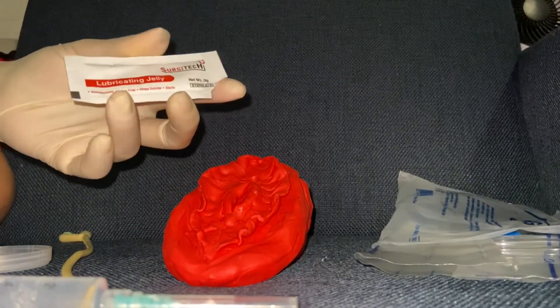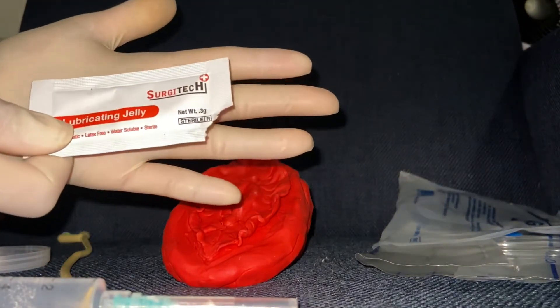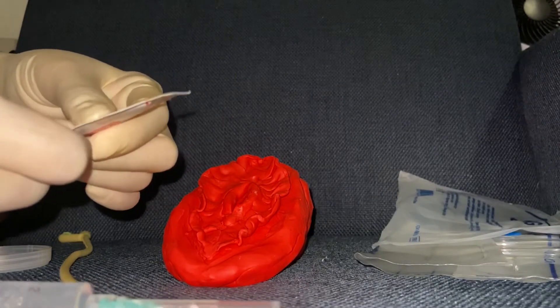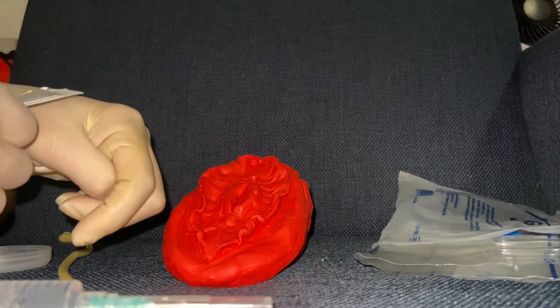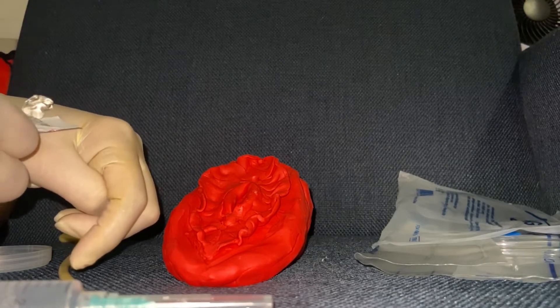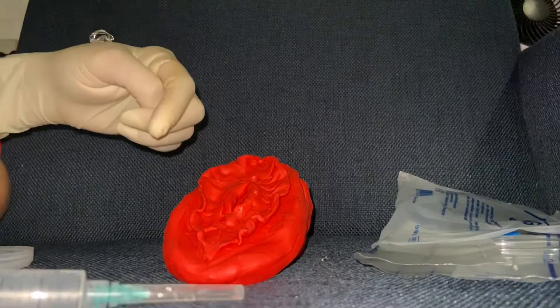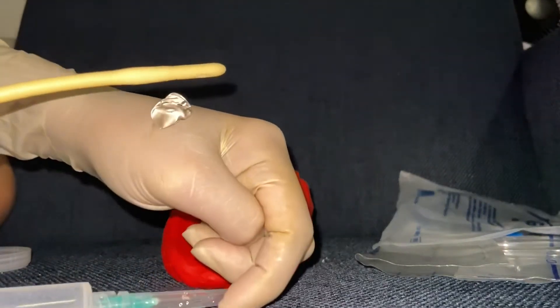Pick up the lubricating jelly and your catheter and lubricate the catheter about 1 to 2 inches from the tip. The reason we lubricate the catheter is to smoothly insert it into the urethra of the patient. Also, the lubricating jelly will help lessen irritation for the patient.